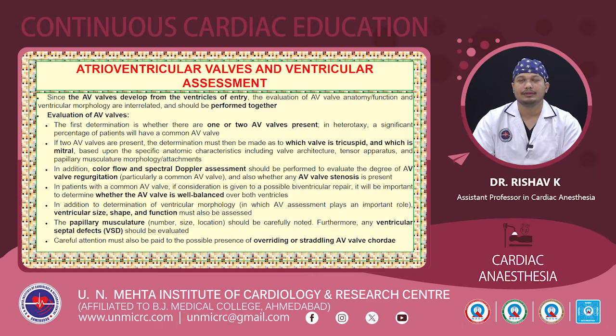So usually the mitral valve will be draining into the morphologic left ventricle, while the tricuspid valve will be draining into the morphologic right ventricle. So the assessment of the AV valves and the ventricles can therefore be performed together. So in patients with atrioventricular concordance, the left atrium will be emptying into the left ventricle and the right atrium will be emptying into the right ventricle. That is left atrium through the bicuspid mitral valve to the morphologic left ventricle, and the right atrium through the morphologic tricuspid valve to the morphologic right ventricle.